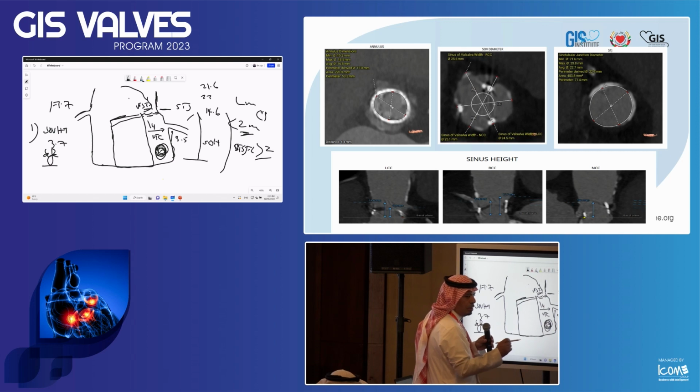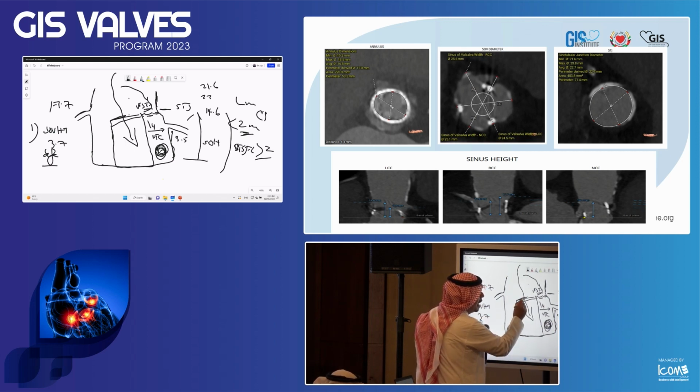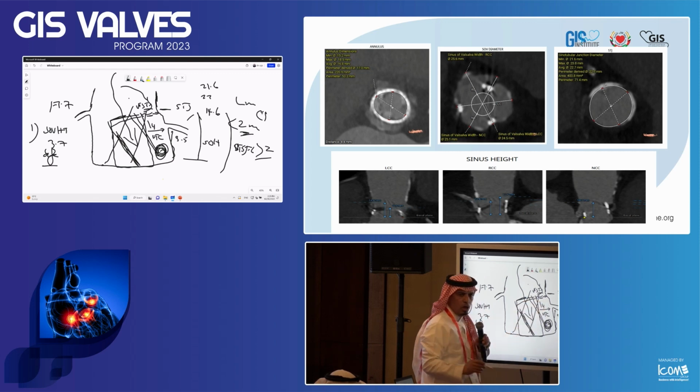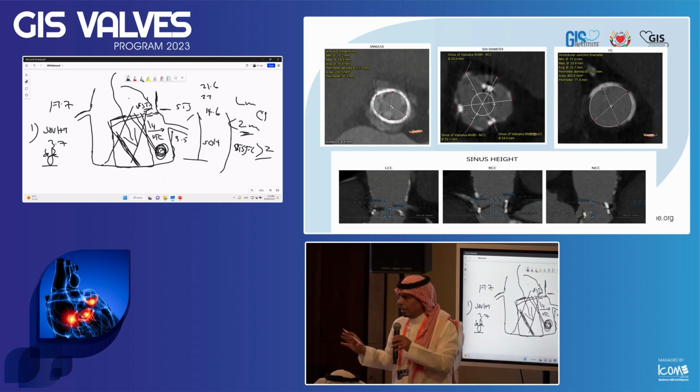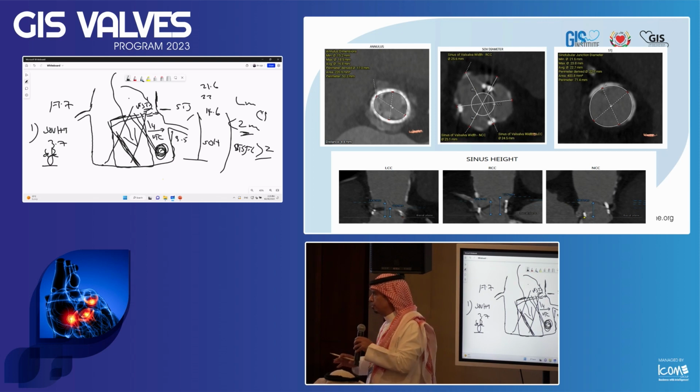This was not calculated. The inclination to the aortic root, the direction of the valve, surgical valve, like this is different from like this. Like this, even if the VTSTJ is wide, you might push it by fracture and you might occlude. So for me, in this particular case, intermediate risk on the left, safe on the right. Personally, I will protect the left main.